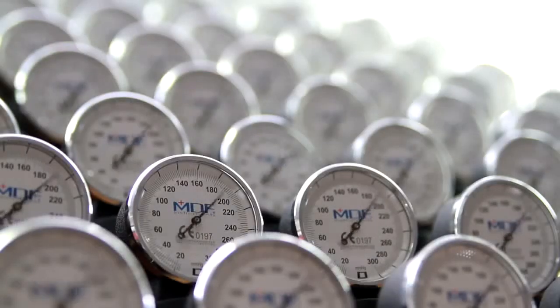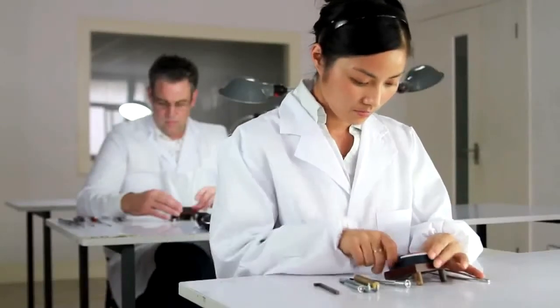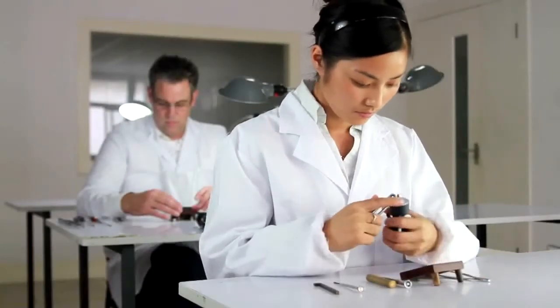We also stress test our sphygmomanometers 3,000 times. And we're not just spot checking — we literally stress test every single unit that we produce.